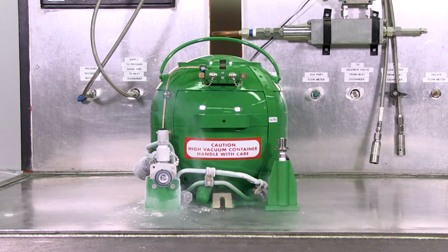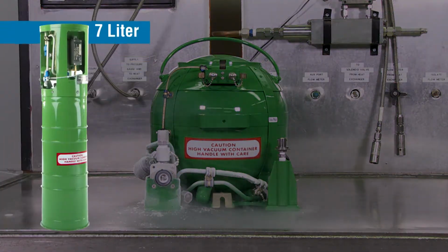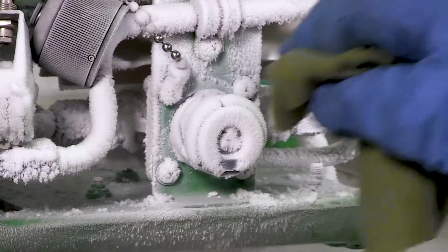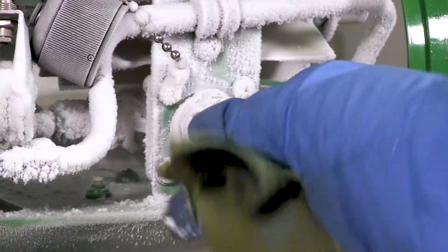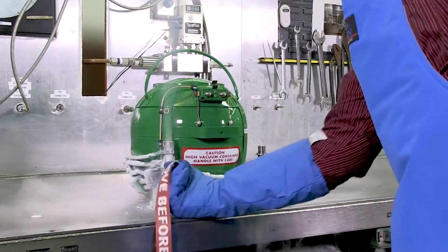The following is a general guide for standard practices regarding Essex 7-liter and 10-liter LOX converters. This training will focus on common troubleshooting procedures so that basic issues can be addressed in the field instead of returning those converters to the manufacturer for repair.